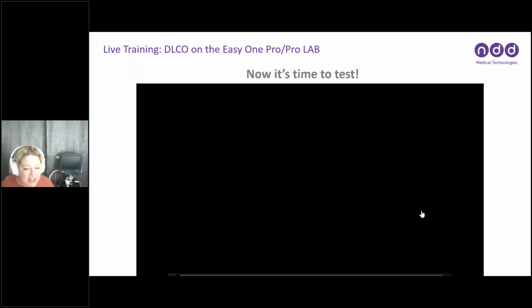All right. Just as a note, we do have different filter solutions for our spirometer. So the spirometry filter that is intended for the Spirette, just remember that is for the EasyOne PC only. The only approved filter for the Pro and Pro Lab devices are the Pro filter kit with the modified Spirette and the filter on the patient side of the mouthpiece.